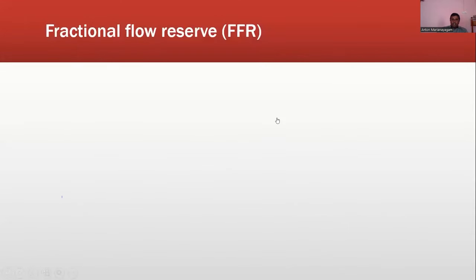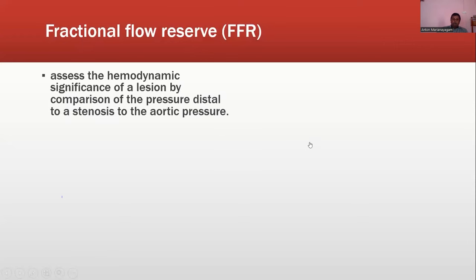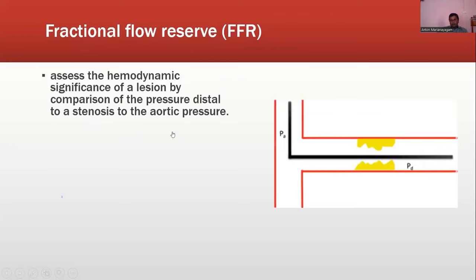Now we are going into fractional flow reserve. This is relatively new, coming for coronary CT angiogram. This is a hope, a promise in the field. We can assess the hemodynamic significance of a lesion by comparing the pressure distal to the stenosis to the aortic pressure.